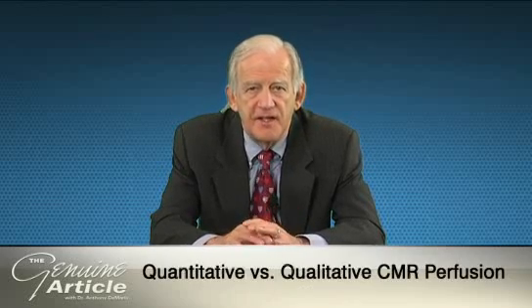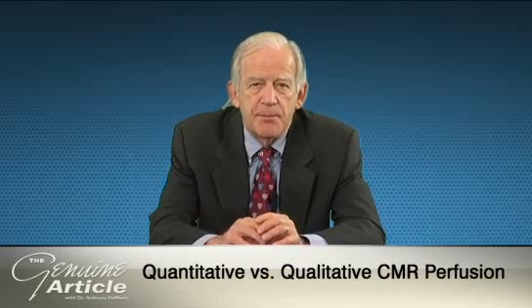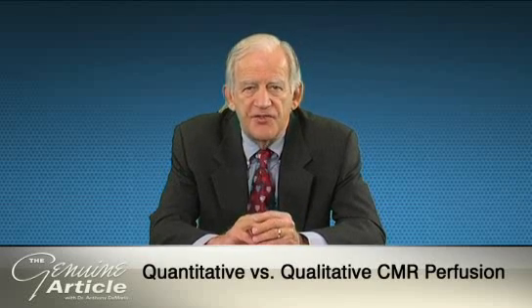It performed better against FFR than it performed against quantitative coronary angiography, again, because we're answering questions about physiology rather than anatomy. Well, it's certainly an attractive concept, even if it requires a couple of gadolinium injections, to use magnetic resonance perfusion to get physiologic information and to assess ischemic burden and distinguish balanced ischemia.